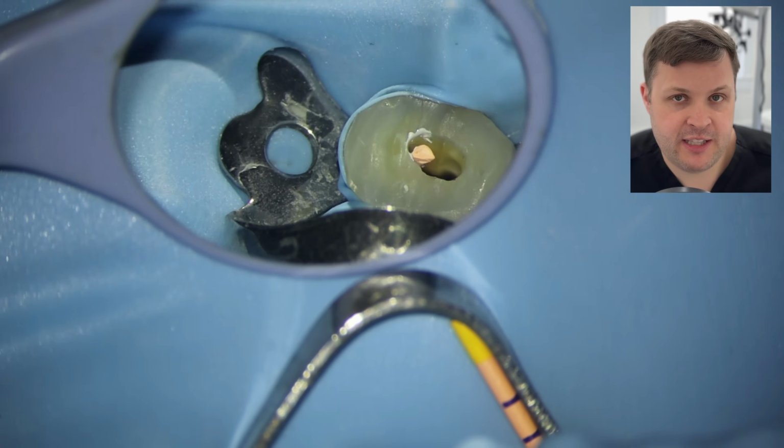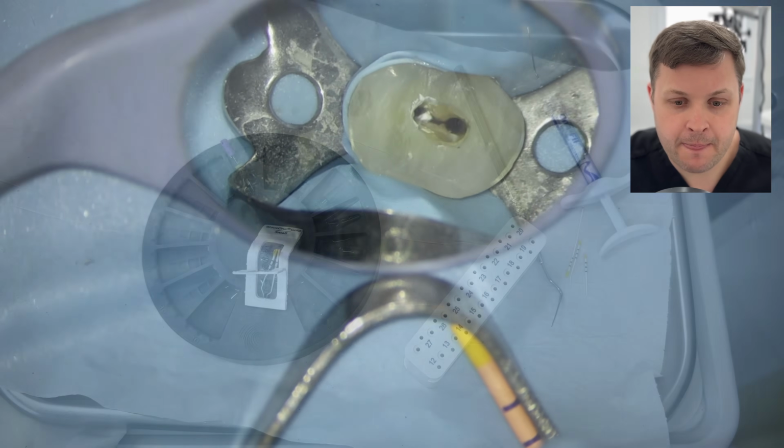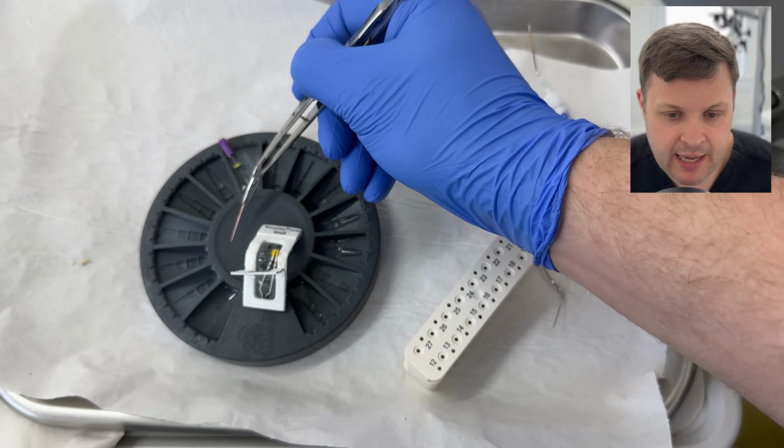You know, I could just fit it to length, but I know that this fits really nicely in the other canal, so I don't want to tempt fate. I'm just going to pull it out very quickly.